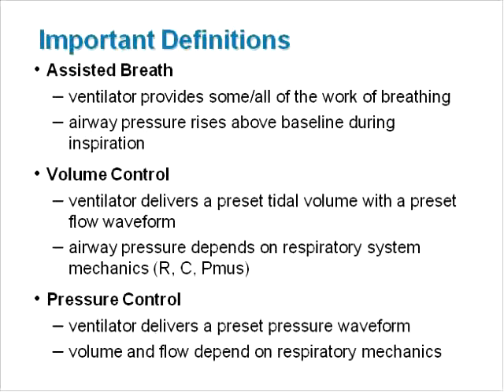Volume control is a mode of ventilation for which the inspiratory volume waveform is preset, and airway pressure depends on respiratory system mechanics, including resistance, compliance, and patient effort. Patient effort is often described in terms of ventilatory muscle pressure, or PMUS. Pressure control is a mode of ventilation for which the inspiratory pressure waveform is preset, and the inspired volume depends on respiratory system mechanics, again including resistance, compliance, and patient effort.